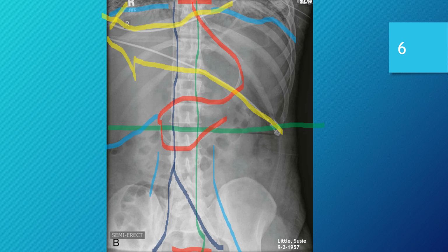And this, while of course we have to commend them for their effort, is definitely not good. Our anatomical marker is located in the area of pertinent anatomy, and we don't want that. The anatomical marker should always be placed in an area where it will not end up in pertinent anatomy and cause obstruction like this.